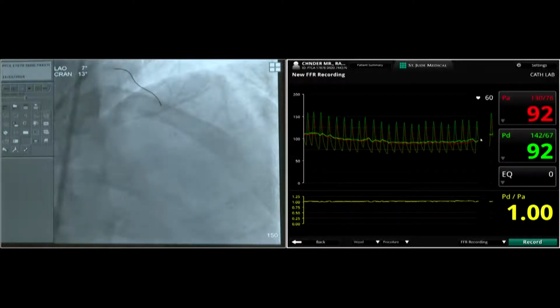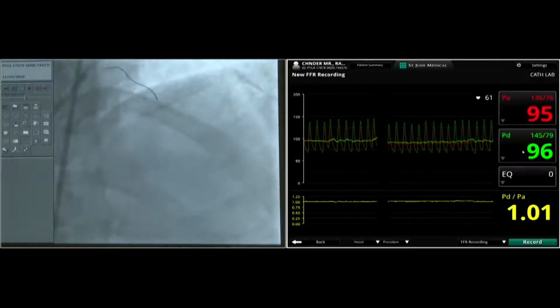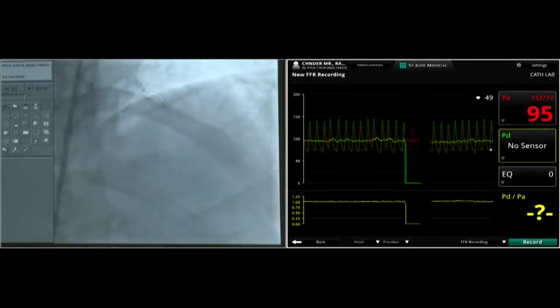Exactly. And actually, take into consideration in a live case, when the wire is getting damaged in the recently placed scaffold, there's more trauma that will probably happen to the vessel trying to repeatedly attempt. Yeah, I think it's a very reasonable point.